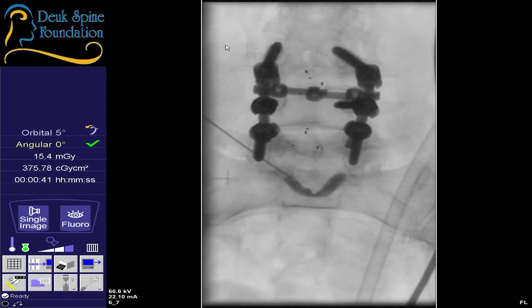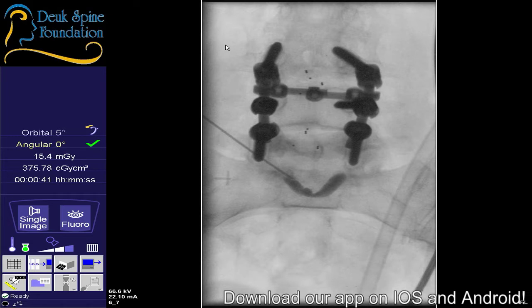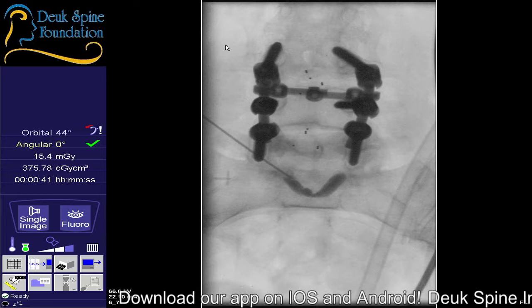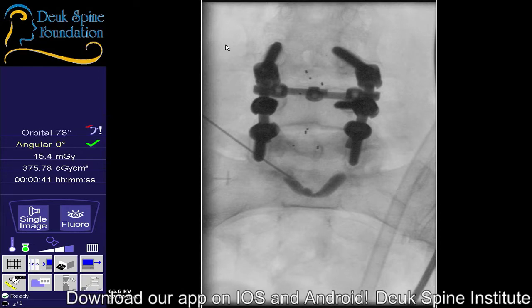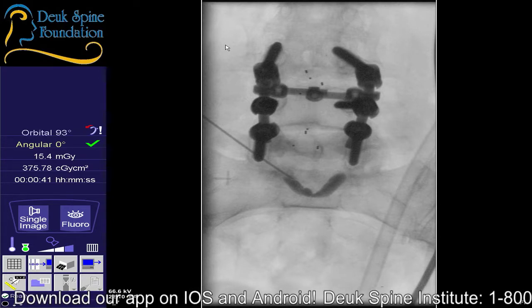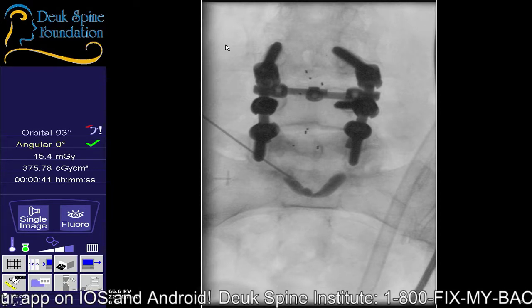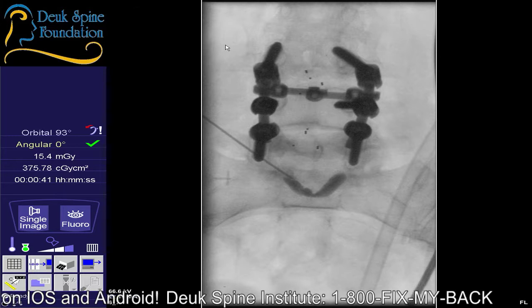Okay, folks, did you see that? That is a discogram. There's no warning. There's no signaling. She has no idea I'm injecting the disc. But you can see it created horrible pain for her. That's because the disc that I just injected is the cause of her pain. That is a definitive test. It's called a discogram. Very few doctors do it. Insurance companies hate when you do it because it ends up sometimes resulting in surgery, and they don't want to pay for surgery.